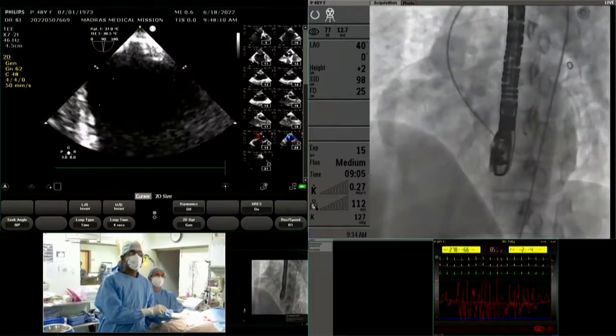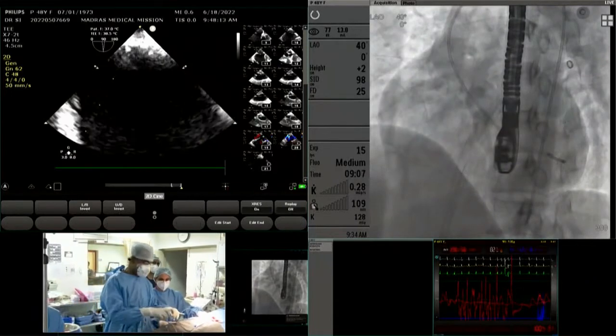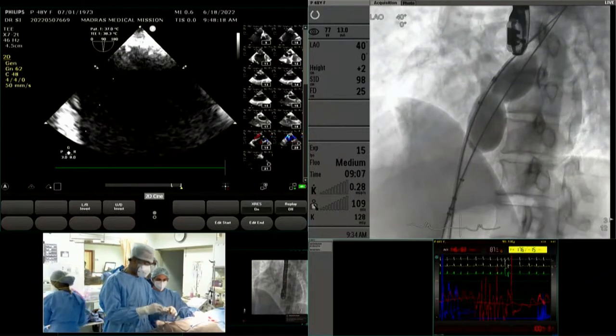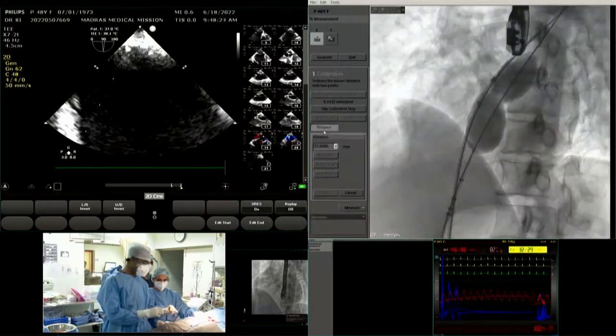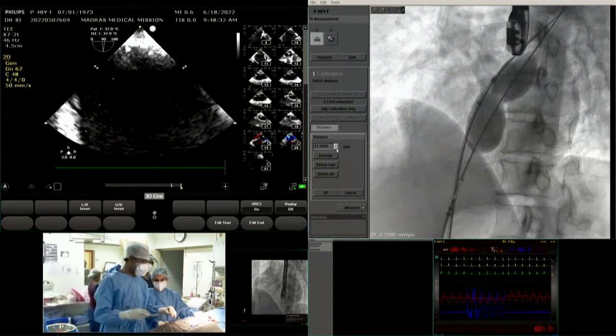Shiva, Dr. Bhavesh here. Pramod, have you measured? Yeah, Dr. Bhavesh. From your 25, 28 patients of multiple ASDs with the balloon sizing, did you find any equation where you can have an idea that their size is nearly 25-30% larger when we use the balloon? Some equations are there? More or less like that, Bhavesh. In general, it is something like around 25% higher. So did you find it is the same as a native single ASD?